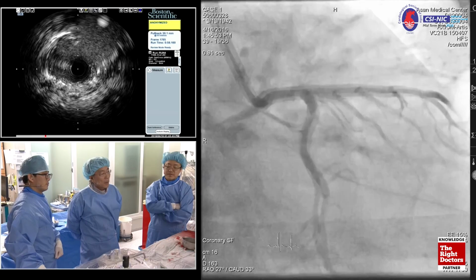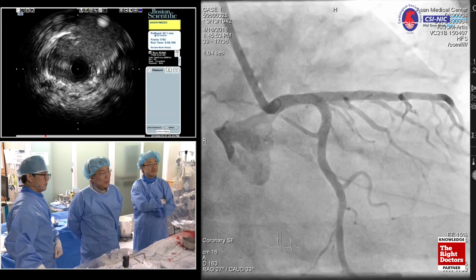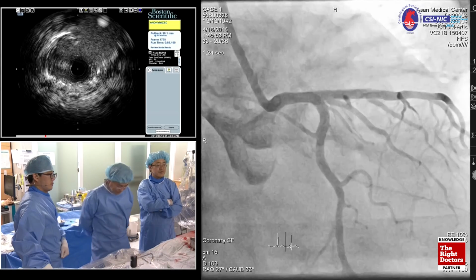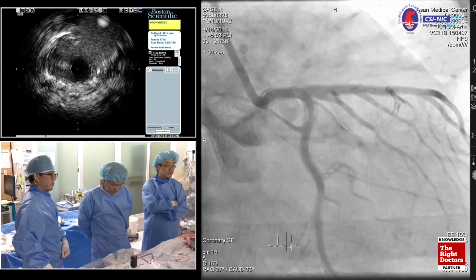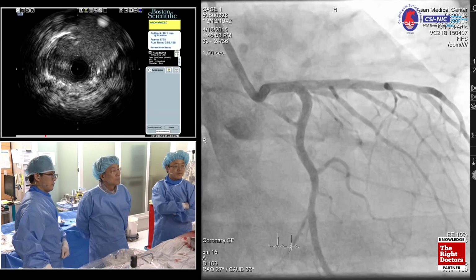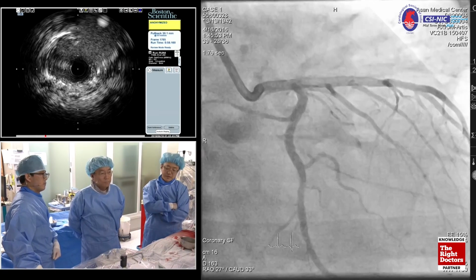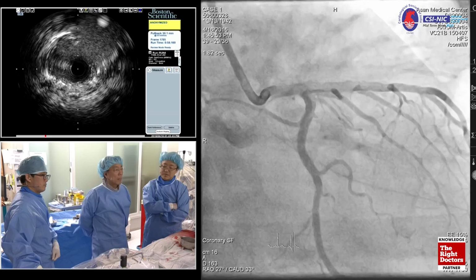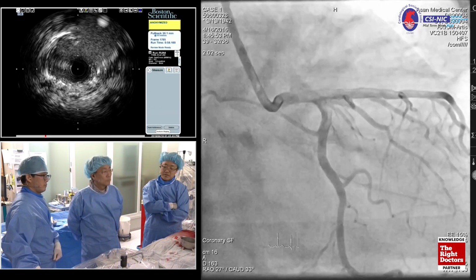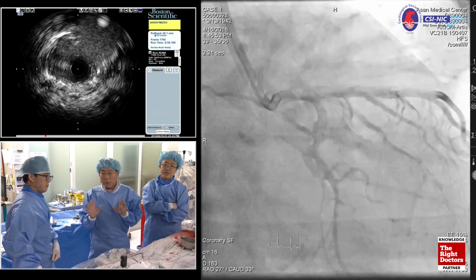Yes, my focused question is if we cannot apply DEB alone, that is the trouble. So my personal view, the most predilection site of recurrence is the circumflex ostial area. So in the case, second stage, I prefer to do the culotte stenting to save the ISR in the left circumflex ostial area. But we don't have data. So main to circumflex option and another culotte stenting, that is my most preferred strategy in case of failure of balloon alone. Great. Good.